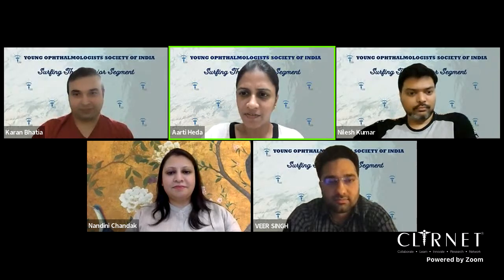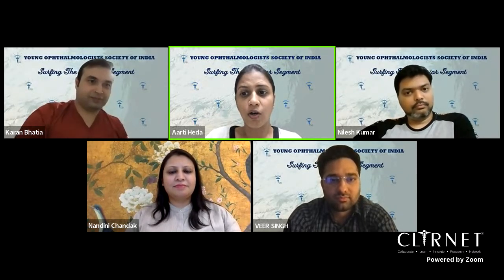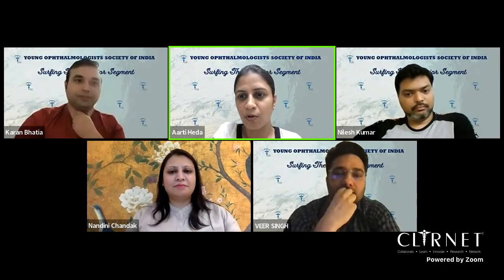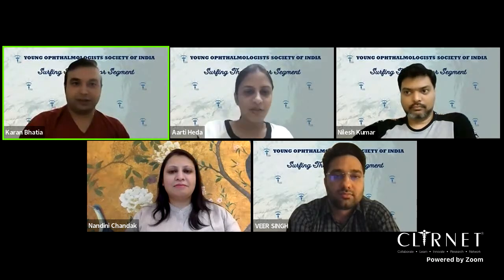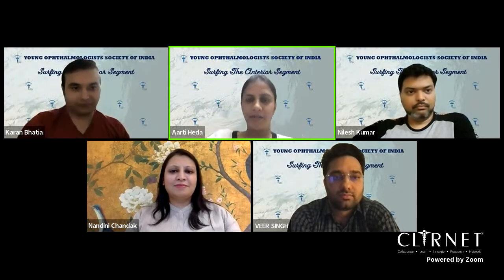The power depends on the A constant as it takes into consideration the effective lens position. So it's a question from Dr. Survey. Karan? Yes, it's on the basis of the ELP only. That's why the constant that you use. Yeah. So, Karan, over to you from here onwards.